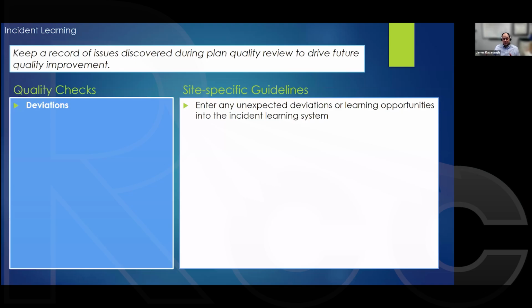But they use the isodoses because it is not a uniform index in all directions. It is still bulging a little bit laterally versus anterior-posterior. So a number is useful, but it can mask certain nuances in the individual plan. Our physicians don't typically use that, to the point where it's not even part of their directive. So as a group we don't use it either, but we do spend quite a bit of time getting familiar with what these should look like.